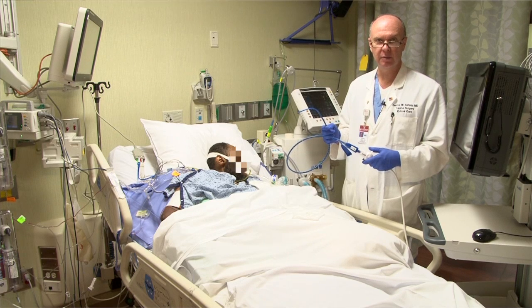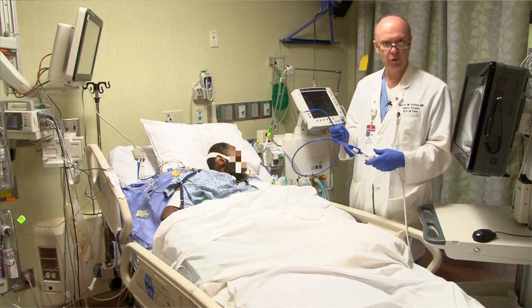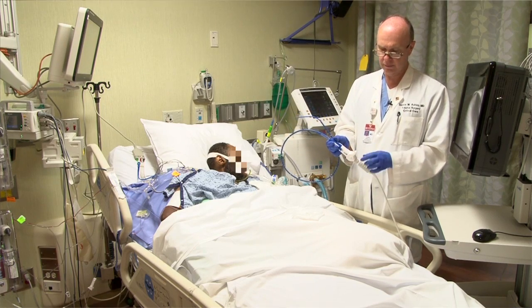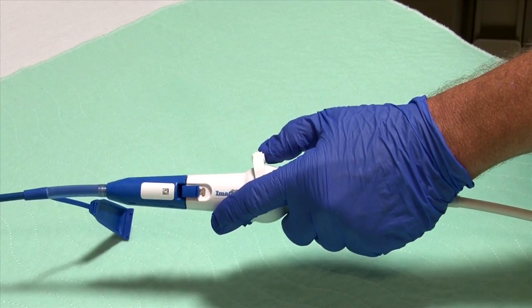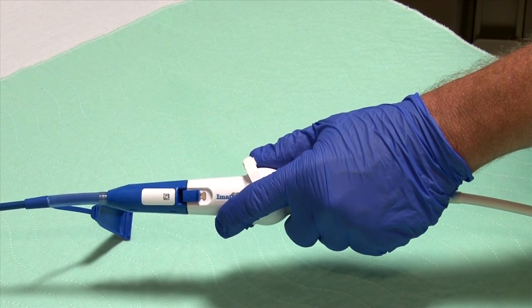Now that the probe is attached and the system is ready to go, we're ready to insert the probe into the patient. Let me point out a couple of things before we do that. You can see here on the handle our lever, and we can move that toward the end of the handle or toward the probe, which is retroflex.